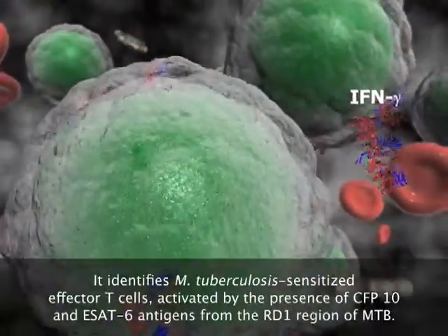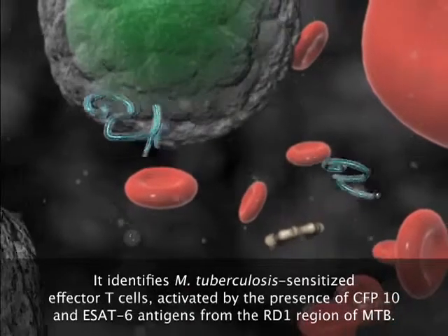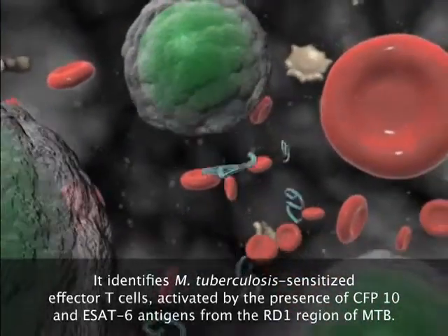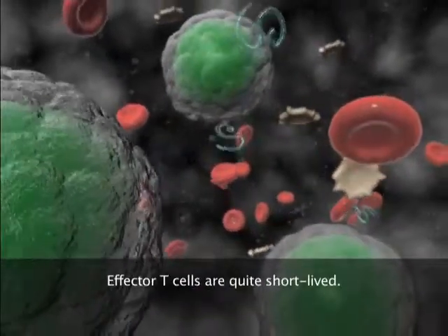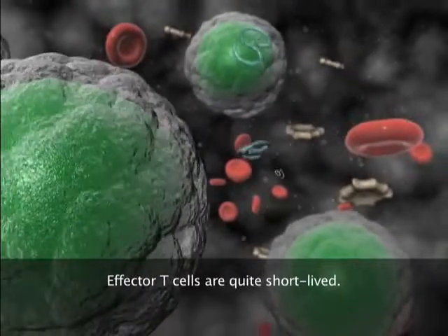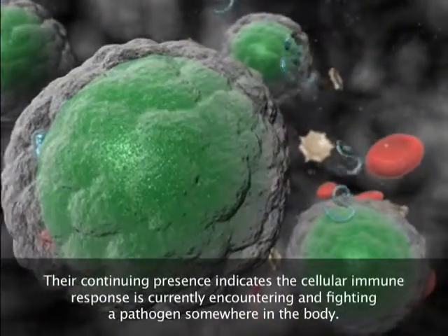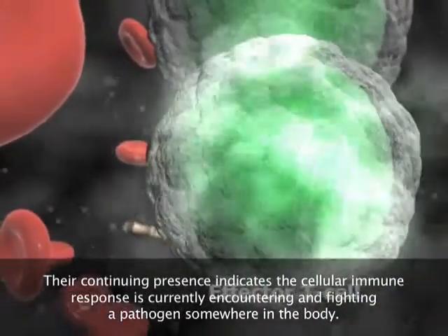It identifies M. tuberculosis sensitized effector T cells activated by the presence of CFP10 and eSAT6 antigens from the RD1 region of MTB. Effector T cells are quite short-lived. Their continuing presence indicates the cellular immune response is currently encountering and fighting a pathogen somewhere in the body.